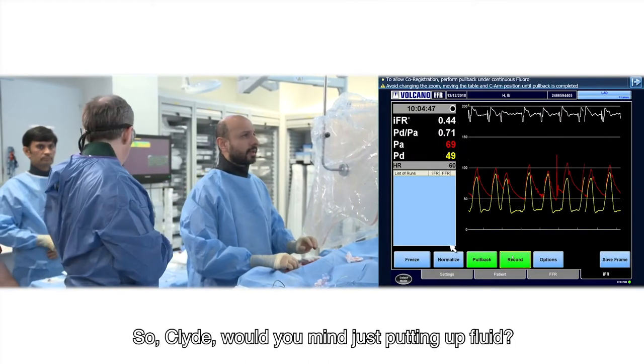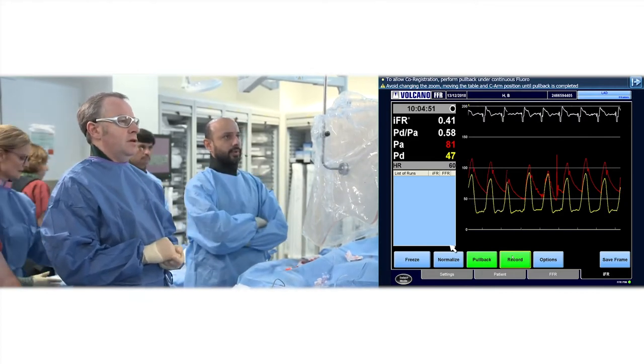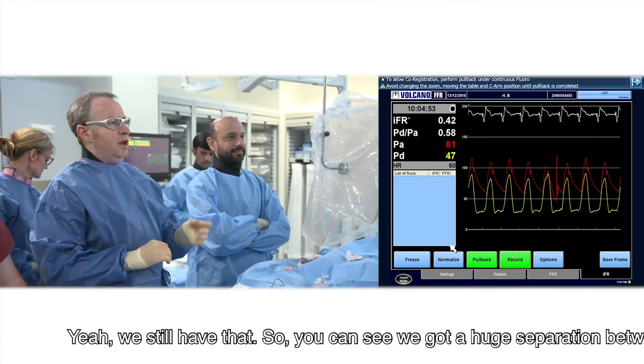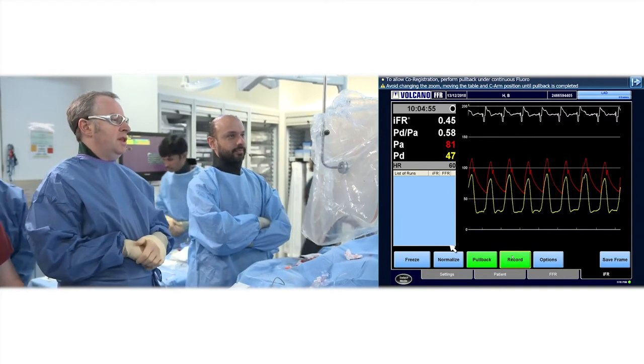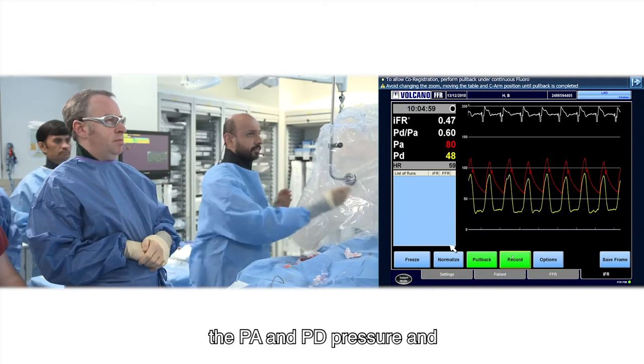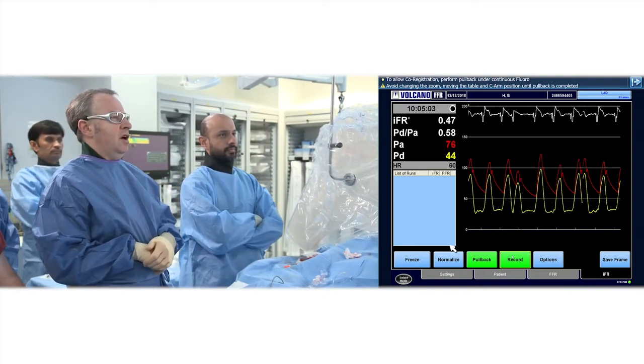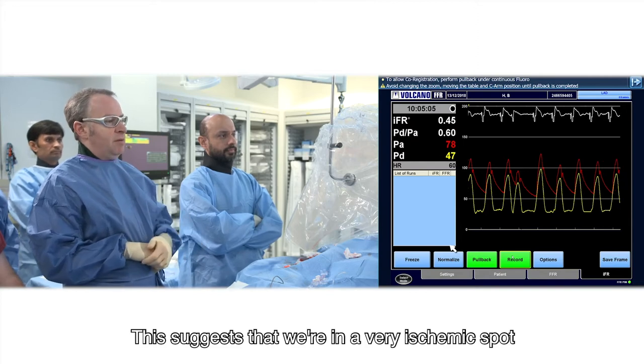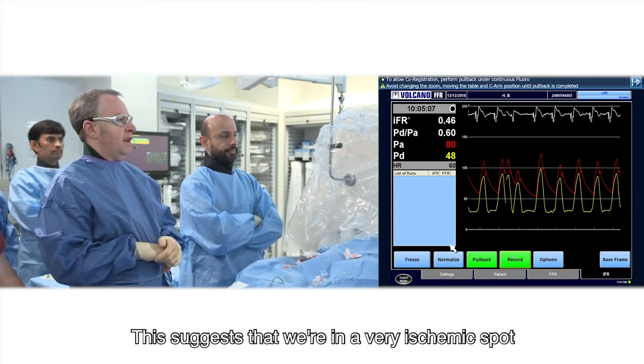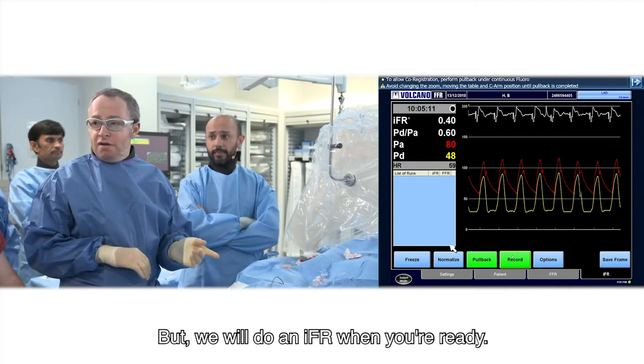Would you mind just putting up a fluid? So you can see we've got a huge separation between the PA and PD pressure, and the PD-PA ratio is 0.6. This suggests we're in a very ischemic spot of the LAD based on that reading. But we will do an IFR when you're ready. Just do an IFR.